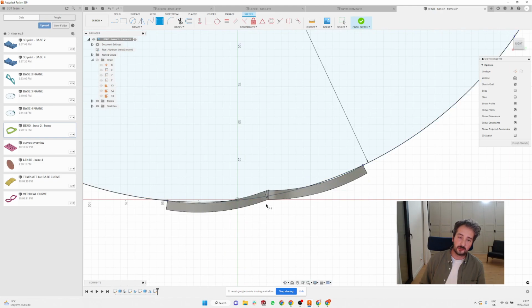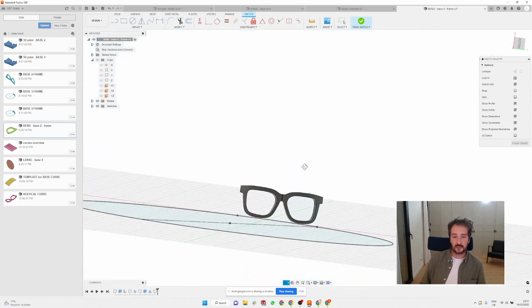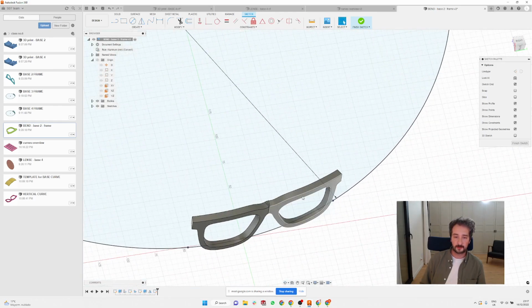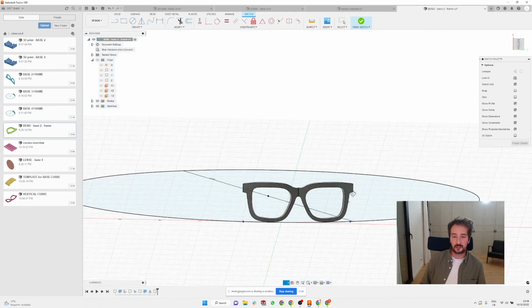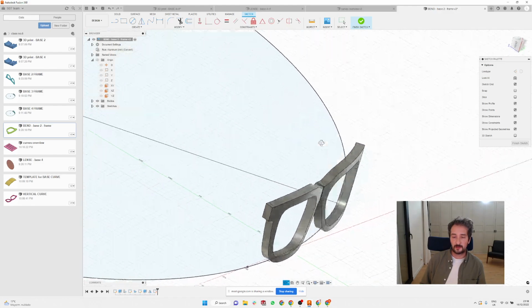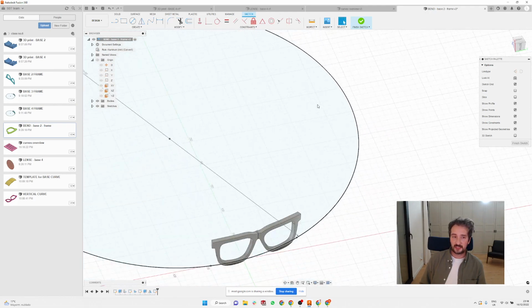If you imagine, here you will have a bridge bump, so it will be much narrower and much closer to actually a base 2 curve. So that's one way you can approximate the base curve. If you make some design and you want to decide which base curve you want, that's kind of an easy way to do it.